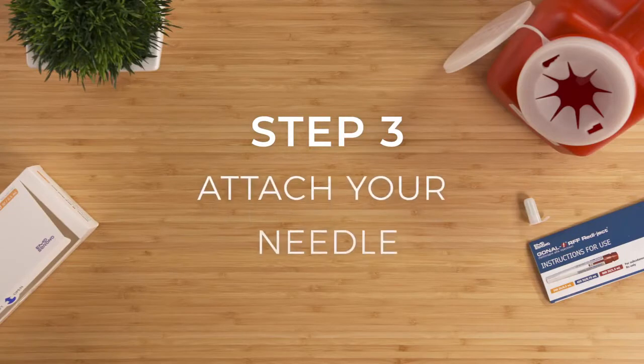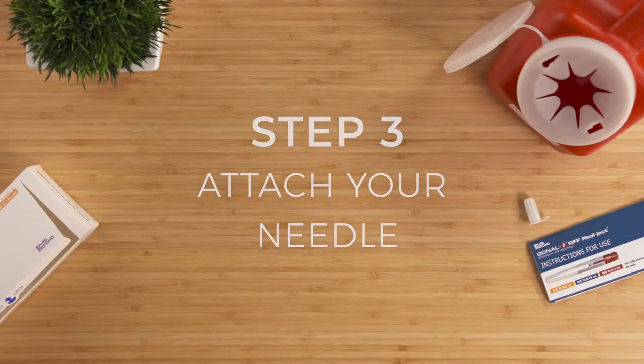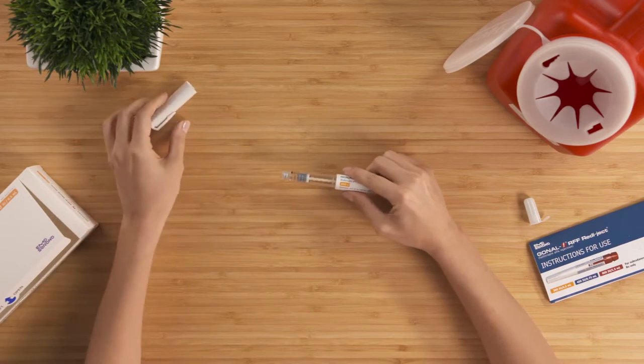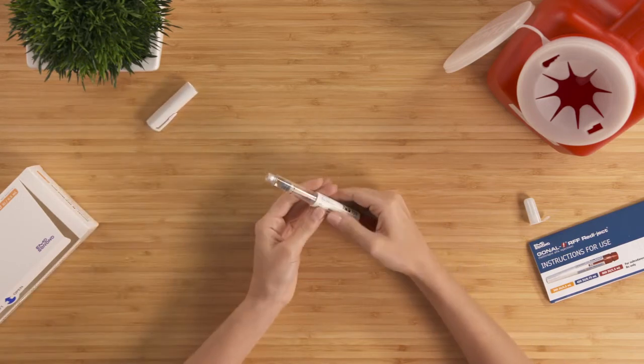Step three, attach your needle. First, pull off the pen cap. Make sure the plastic reservoir that holds the medicine is not cracked.